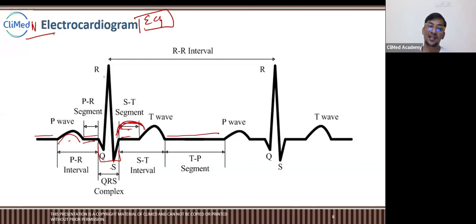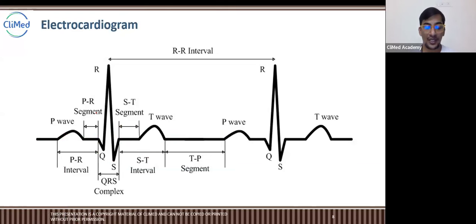In NSTEMI, it will be inverted, ST depression, like that. So these are the major changes in ST elevation and non-ST elevation MIs.